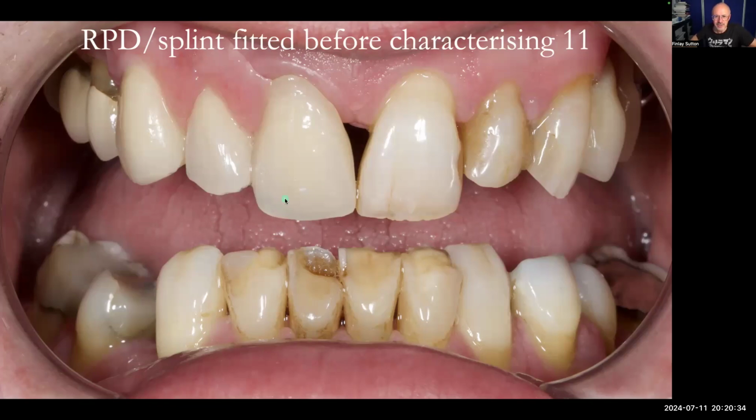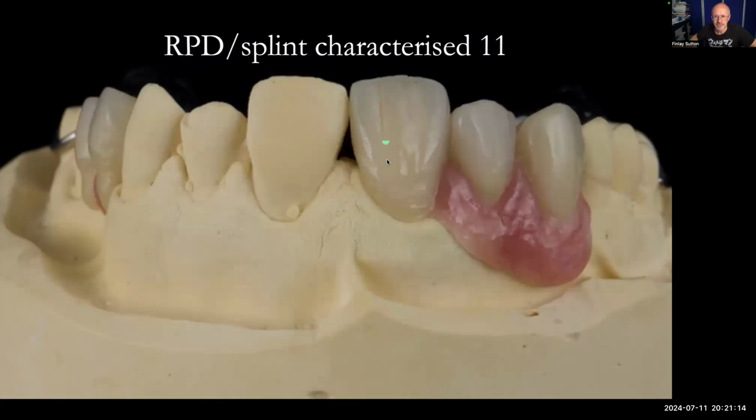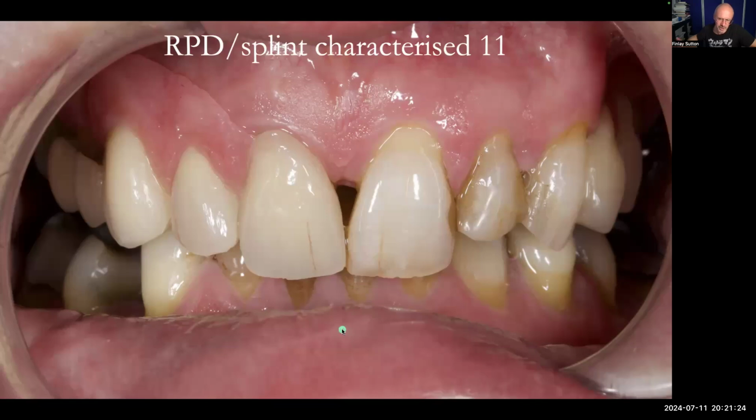But the other thing we did too, can you see there's a little crack in that central incisor and a nice little bit of staining, and none in that tooth. This looks too perfect. So what we did was we just put a nice little crack in that with a blade and some other little stains, a little bit of chipping. This is using OptiGlaze composites and a scalpel blade, sandblast, and then add the composite. It's really good. Lovely. So that's it there. You can see that with that nice characterized upper central and characterized lateral too. And it looks nice. So it just starts to look real.